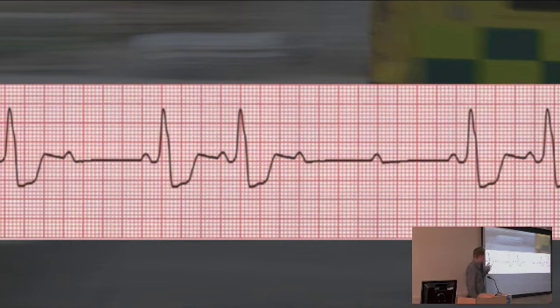Well, you've got a P wave and a QRS here. You've got a P wave and no QRS here. You've got a P wave and a QRS here, good PR interval. And again, same PR interval. Nothing. Then a P wave, QRS, and a decent PR interval. So okay, it's conducting at times with an all right PR interval. And then it's missing some. So what does that make it?